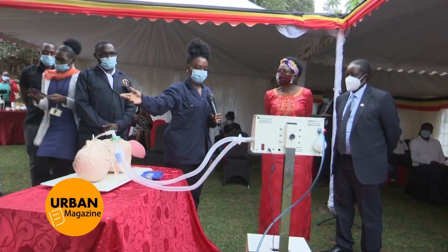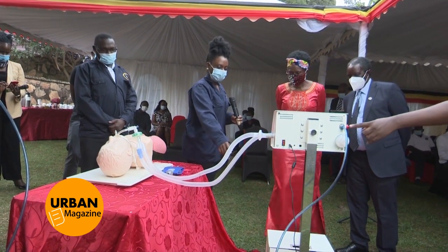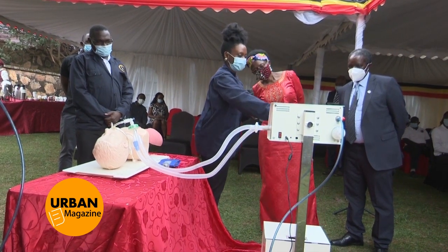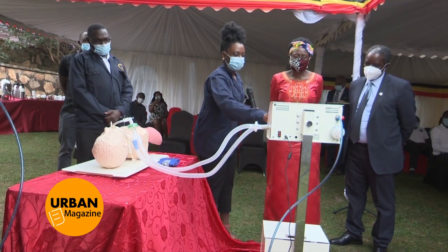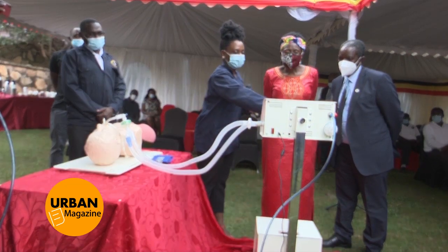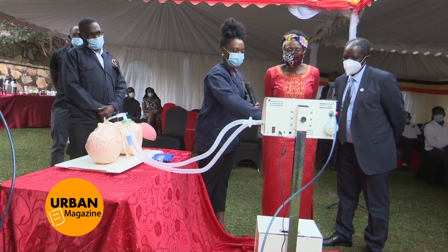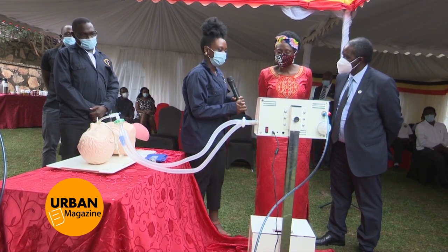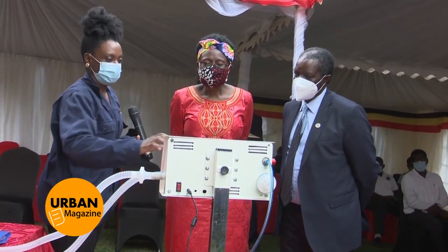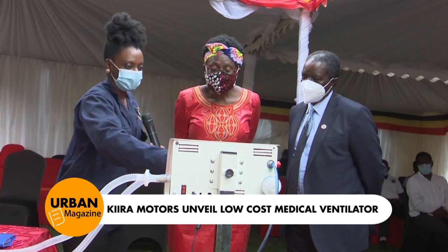Supply system for our ventilator. It comes into the ventilator behind there. We have the power supply system, which we hook up at the back, and then we switch on the ventilator. And once we turn it on, we can see all the collaborating institutions. We can set the parameters for the ventilation depending on the patient you have. As we've been told, COVID-19 patients require, for example, an IE ratio of 1 to 3. So the settings will vary depending on the different patients that you have. And then we can start the ventilation.